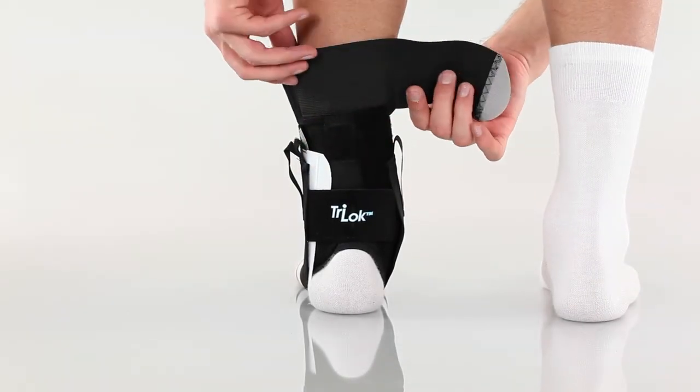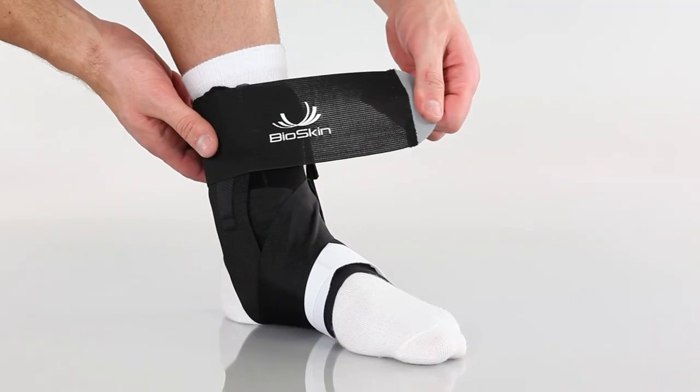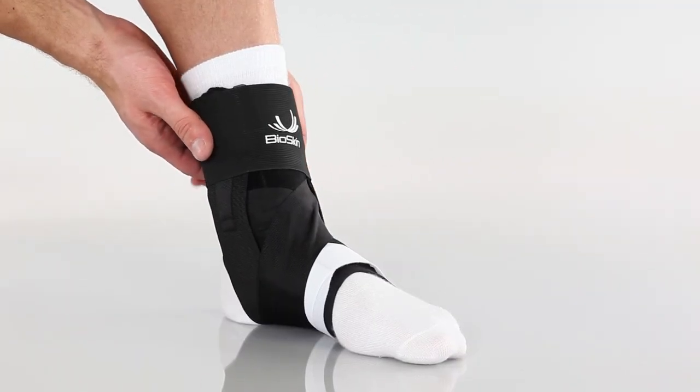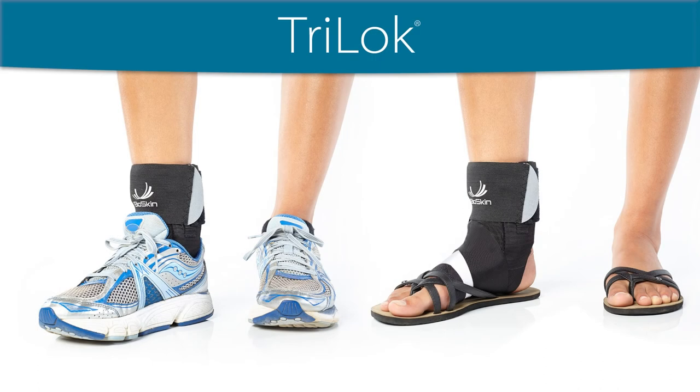To finish, fold down the elastic collar, wrap it comfortably around the ankle, and attach. The ankle is now supported and protected from unwanted movements. The Tri-Lock may be worn with or without shoes and sandals.